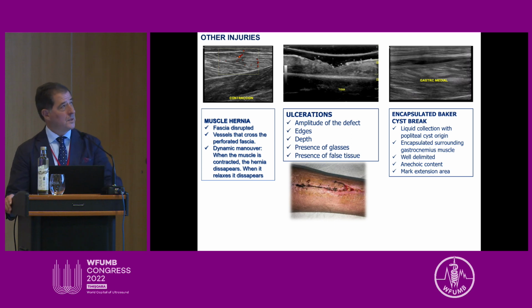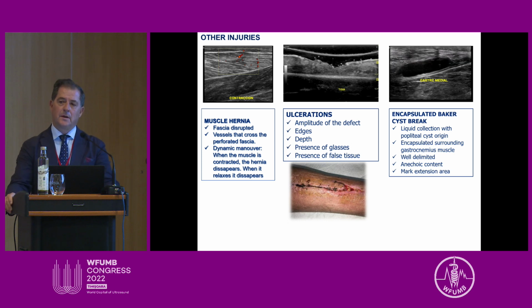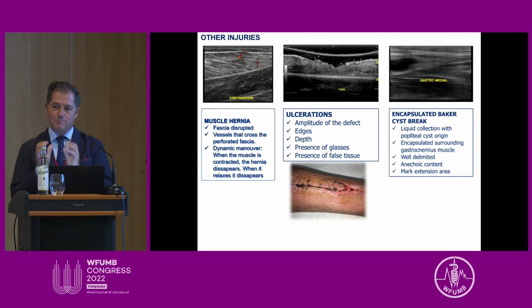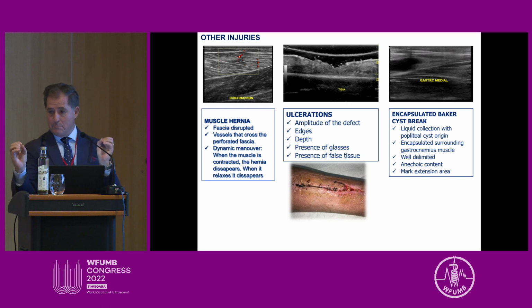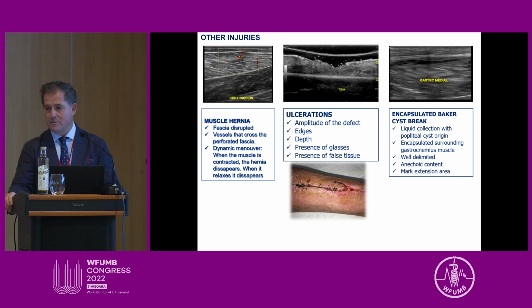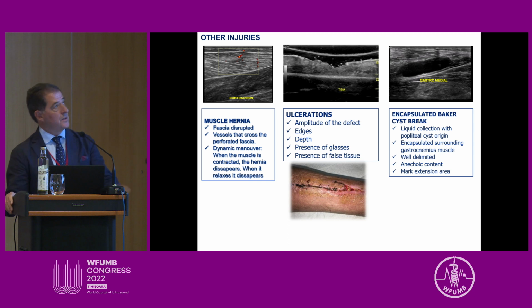But it's very important to reach the place where the semimembranosus bursa is, because in this place, close to the tendon, between the head of the gastrocnemius medialis and the semimembranosus muscle, is the origin of this bursa. In this place, you should look for the origin of this encapsulated Baker cyst.